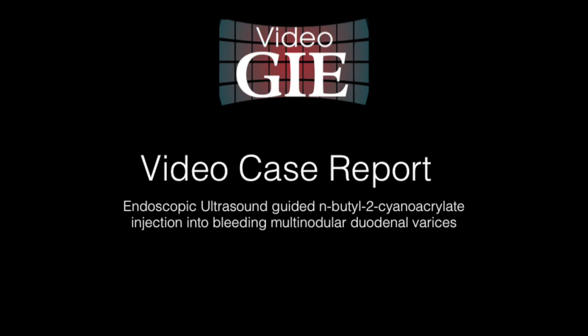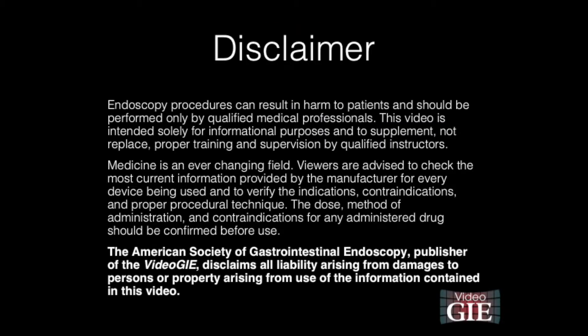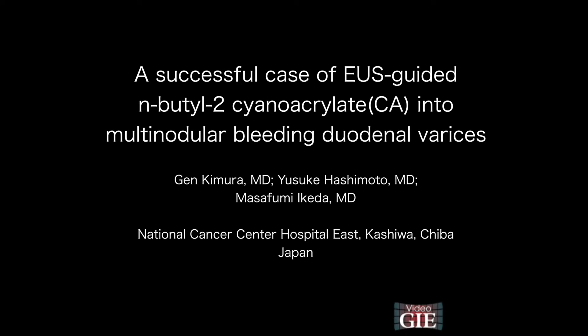Endoscopic Ultrasound Guided N-Butyl-2 Cyanoacrylate Injection into Bleeding Multi-Nodular Duodenal Varices. Successful case of EUS-guided N-Butyl-2 Cyanoacrylate injection into multi-nodular bleeding duodenal varices.